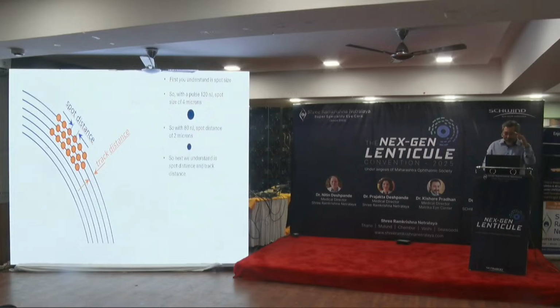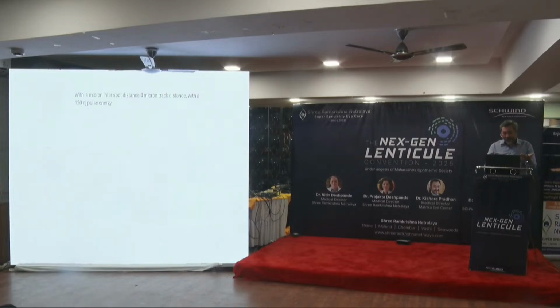And there's something else, the spot and the track distance. The spot distance is not the distance between the two spots. It is the distance between the centers of two spots. Okay? You can control that also. And the track distance is like a racetrack, you can control that. So when your energy increases or decreases, your spot size will change, but the spot distance and your track distance will remain the same.